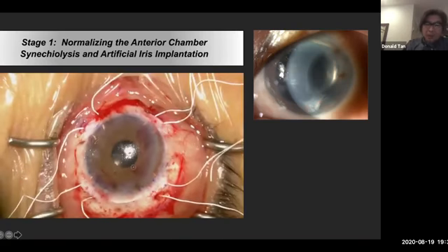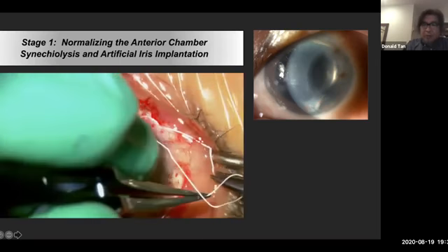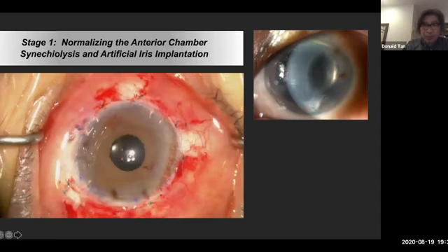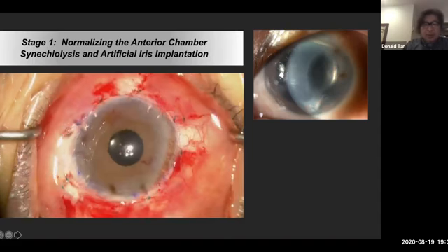What I haven't shown here is I've already removed some of that peripheral iris. I've done a vitrectomy. I tend to use a vitrector to cut away the iris. Don't want to pull, you get hemorrhage. So at the end of the procedure, these scleral incisions are closed and the conjunctiva is all closed up. And that's the end of that procedure.